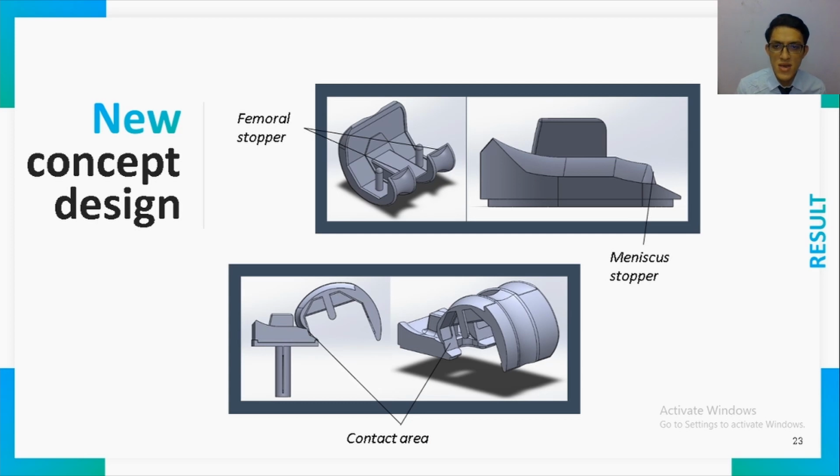Next, typical knee prostheses usually do not have a very high flexion. The femoral component cannot flex higher due to limitation of the meniscus shape. From the principle obtained from the Triz method, the meniscus is designed to have a space at the posterior position of the meniscus and a stopper at the maximum angle of femoral component flexion.